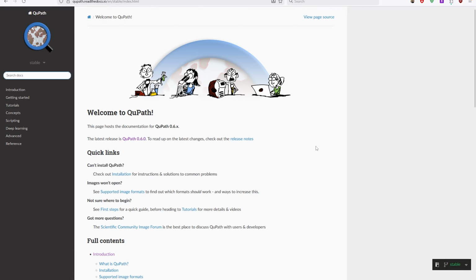So, in this lecture, we have covered a set of tools for QuPath and mentioned that QuPath is a powerful open source software that bridges digital pathology and computational analysis. We covered different annotations such as wand and brush, advanced tools, and other simple tools like the polygon and rectangle. We went through how to select, deselect, and change the opacity. We learned how to estimate the vectors and moved after that to cell detection using cell detection, positive cell detection, and fast cell counts.